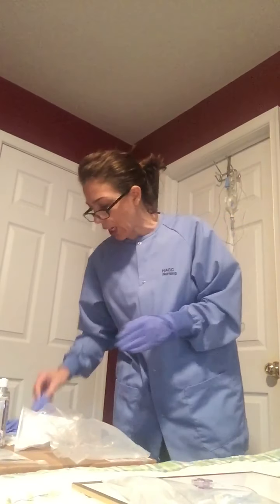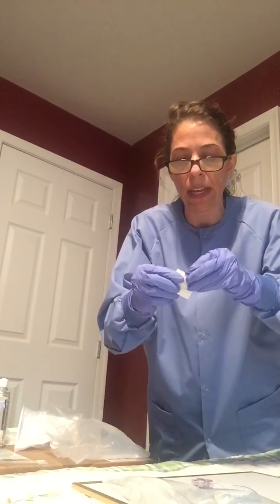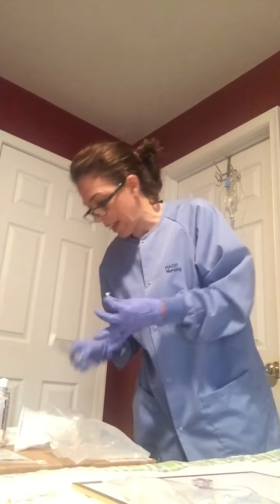I would also have the bag time taped, but we didn't learn that yet, so I'm not time taping my bag right now, but we would time tape the bag. So I'm going to get my alcohol wipe, and I have my syringe.